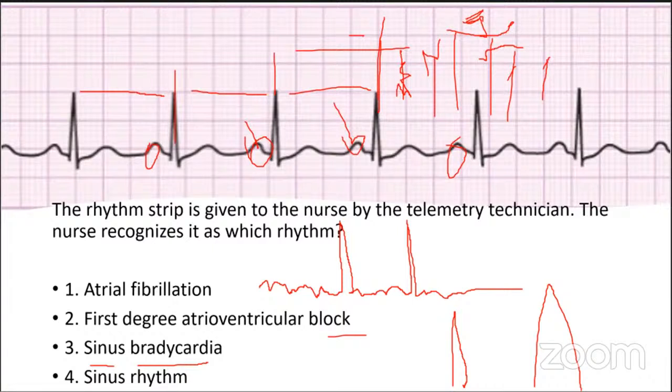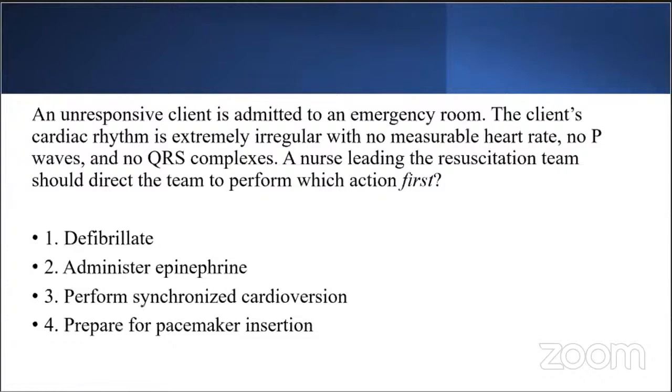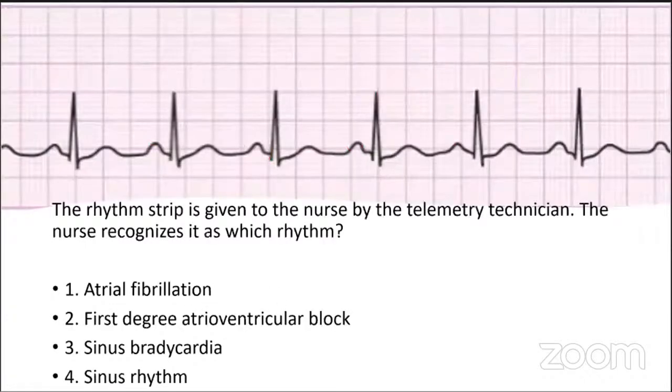I don't want to go into the PR interval now, but the PR interval looks normal to me. Remember, I want it to be less than 5 small boxes. We'll talk about it in the core content course. So if you look at the PR interval, we want it to be less than 5 small boxes. So that's my PR interval there. Sorry, my pen is messing up.